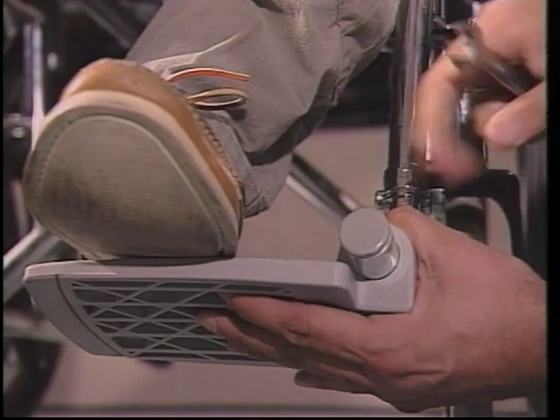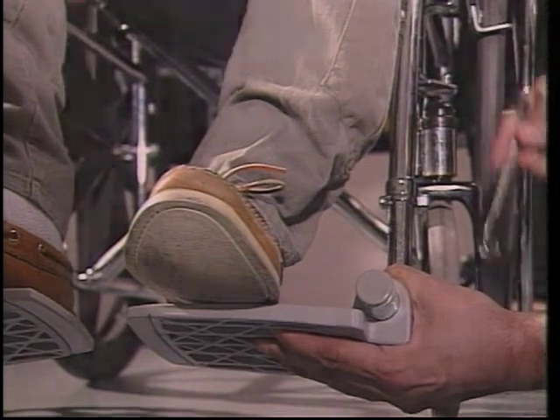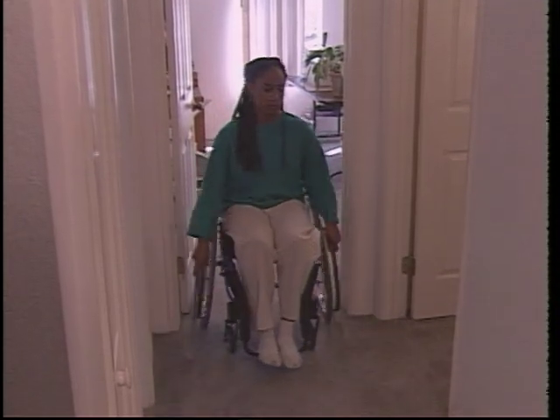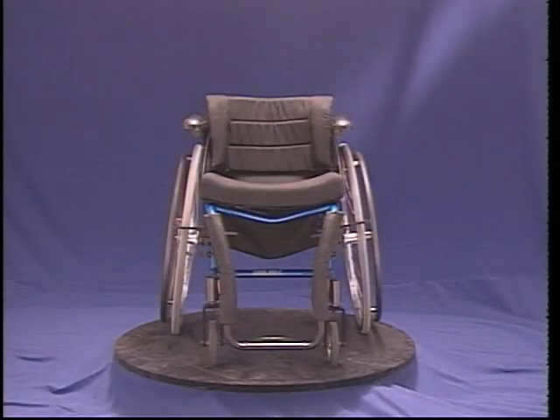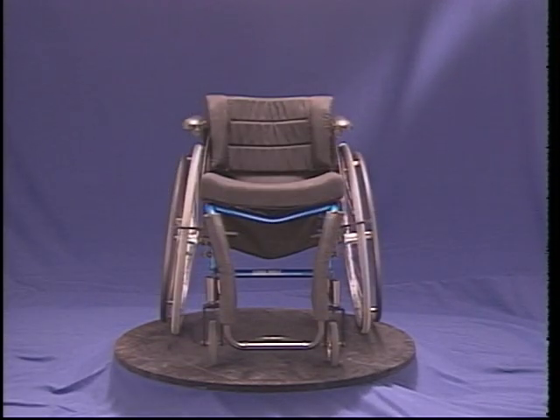Not only can we adjust the environment to make it safer and more accessible, but we can adjust the mobility device itself to increase maneuverability. Wheelchairs, for example. The width of a chair determines its ability to pass through a narrow area, and the chair's length affects its capacity to turn in tight spaces. These can be adjusted to a certain extent. Users of lightweight chairs often camber out their wheels like this to get increased maneuverability, but this of course can impede access through narrow spaces.